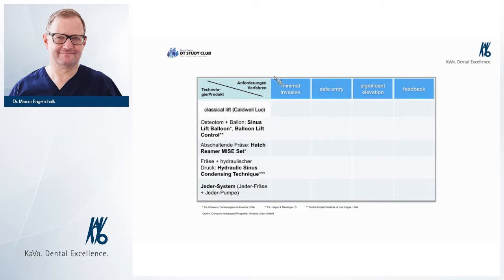And you can use a laser, especially for treatment of the bone. This is a completely different laser than laser surgery for treatment of the soft tissue. So you can select a little bit.